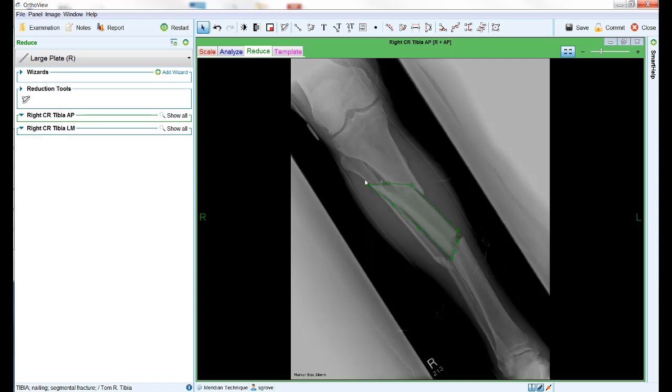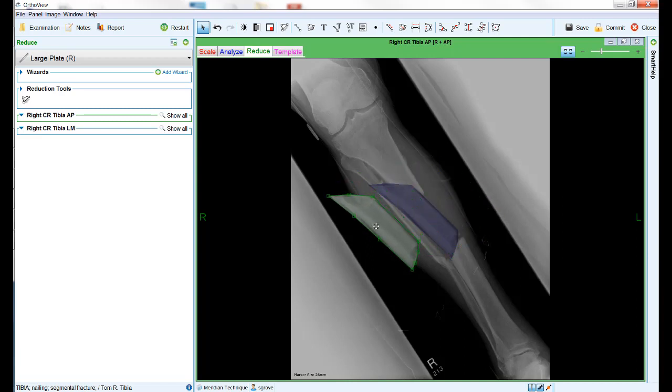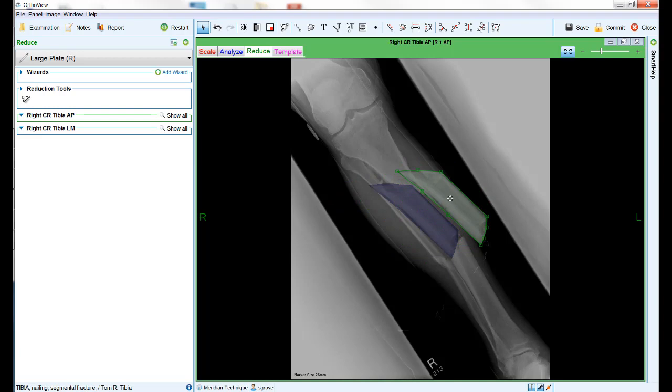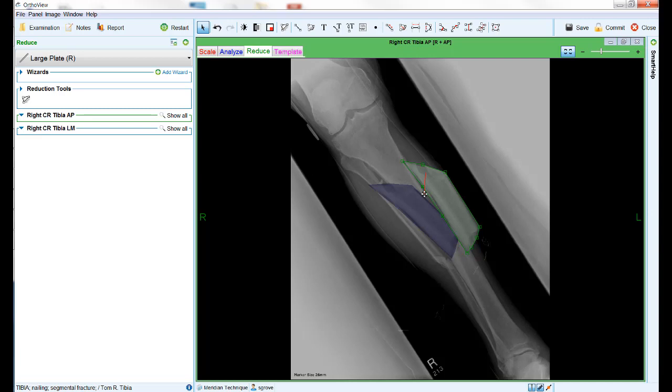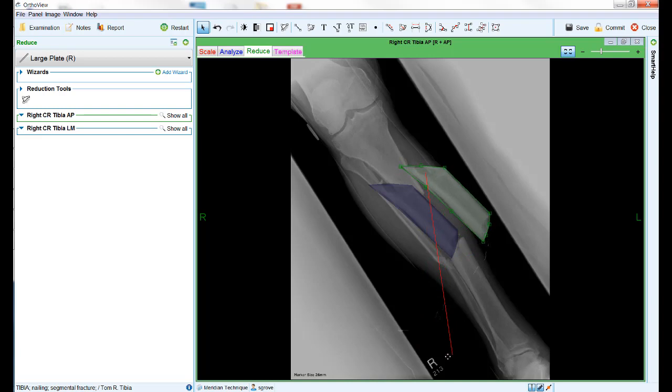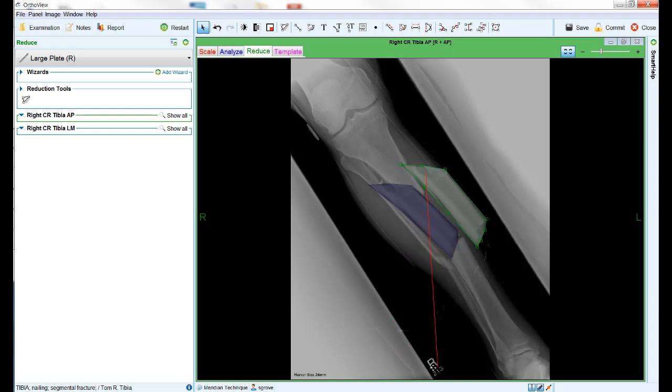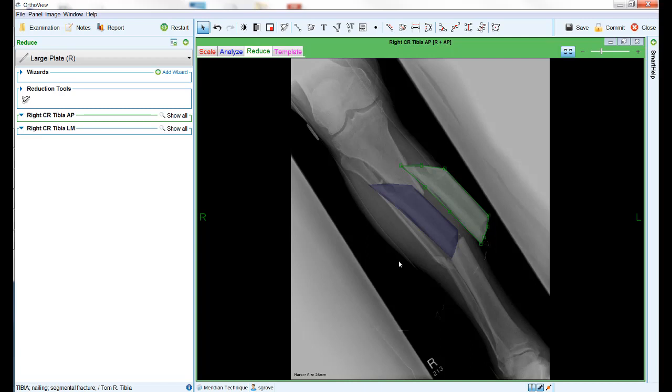Once you have outlined an area to reduce, press and hold down the left hand mouse button with the cursor anywhere inside the outline to move the area around. Holding down the right hand mouse button allows you to rotate the area. The point at which you click the right hand mouse button becomes a rotation point, allowing you to choose the best rotation point for a particular area. Note that with the right hand mouse button pressed, the further you move the mouse away from the initial point, the easier it is to control the rotation.